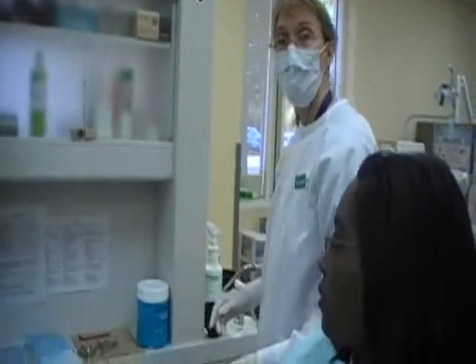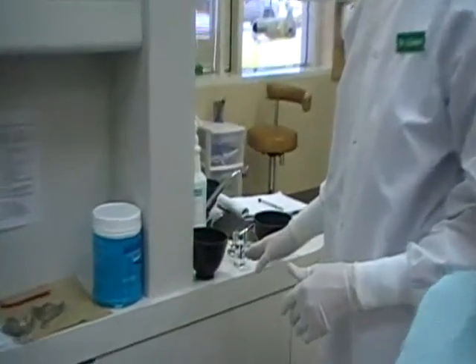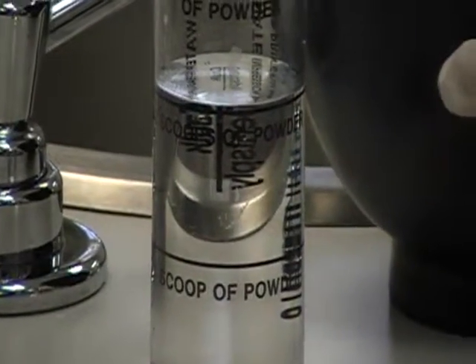The next thing that you want to do is to get your alginate and your water ready to go. If we can focus in on our water level and the meniscus — we're going to be using two scoops of powder, so we want two measures right at the meniscus line.